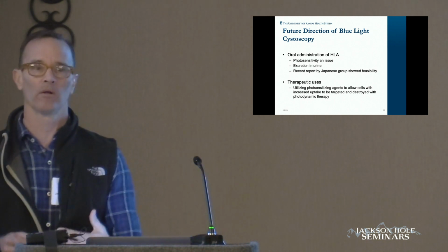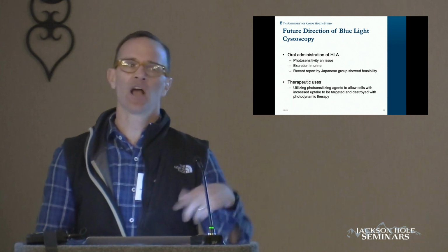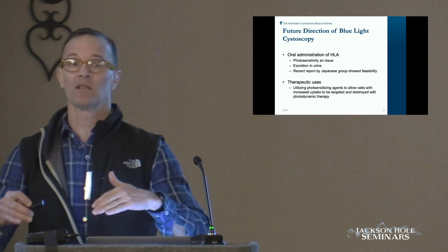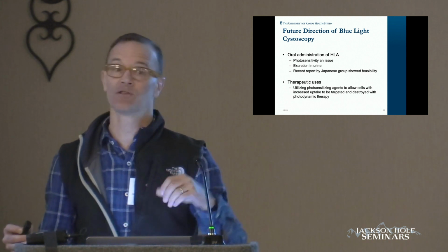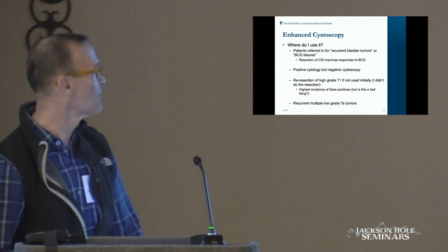Here are some of the future directions, which is the oral administration. That would be sort of one of the holy, I wouldn't say that's the holy grail, but that would certainly help us with this. The challenge has been photosensitivity. The holy grail would be putting this into the bladder and then just being able to shine a wavelength of light that would destroy the bladder cancer cells. And some people have been working on that, but again, we're not there. But I think that's sort of the holy grail on that.